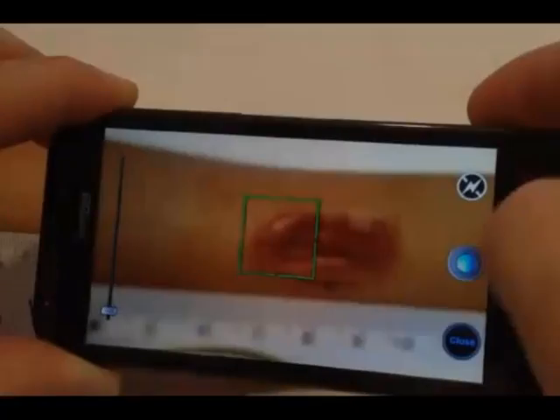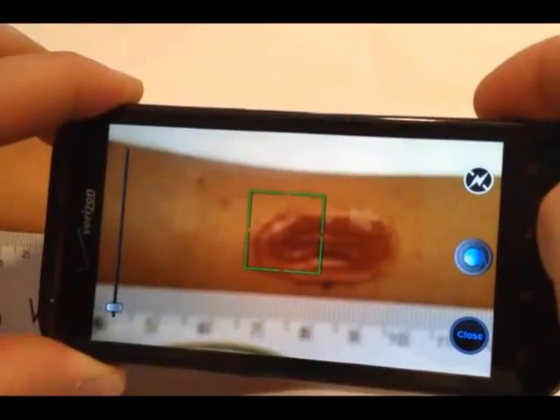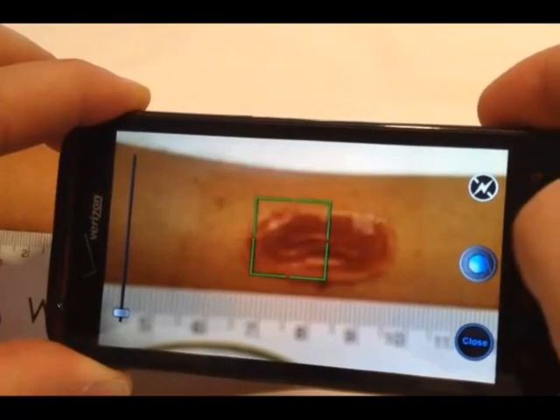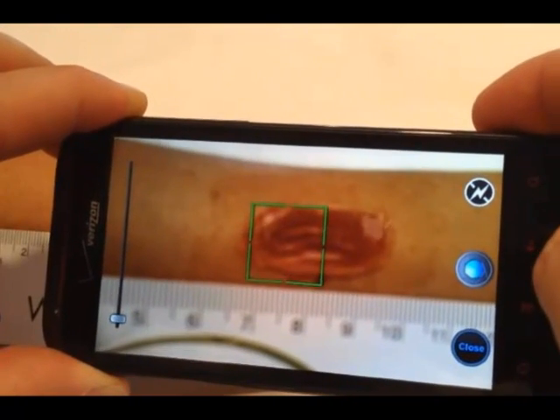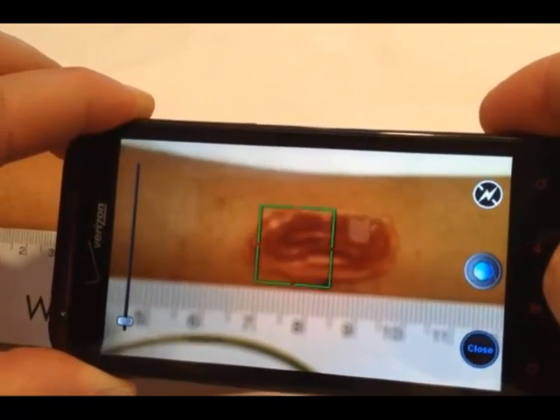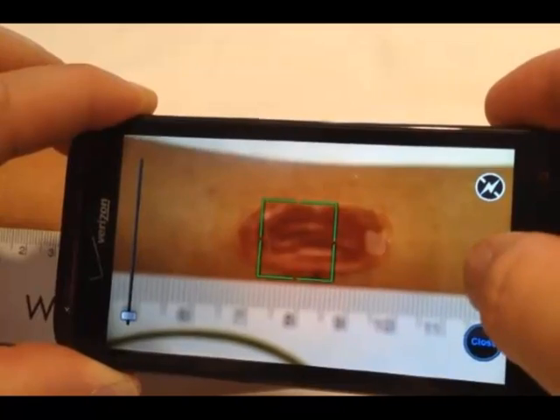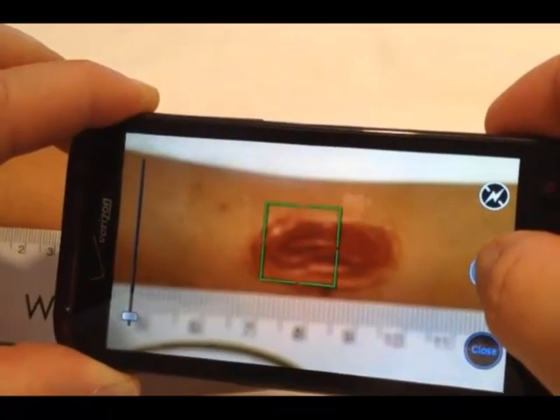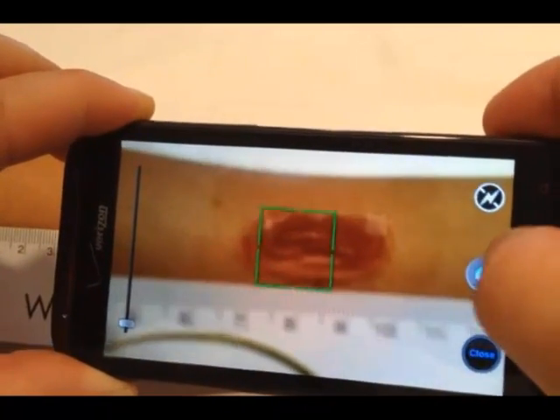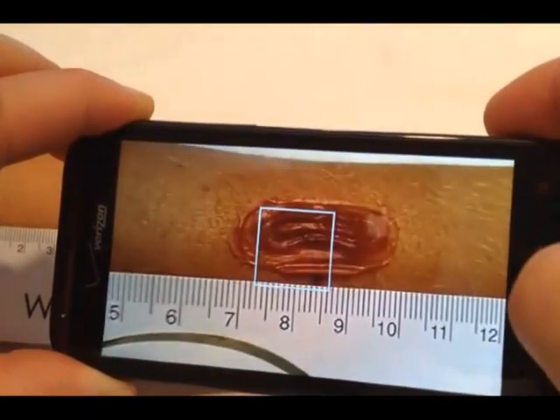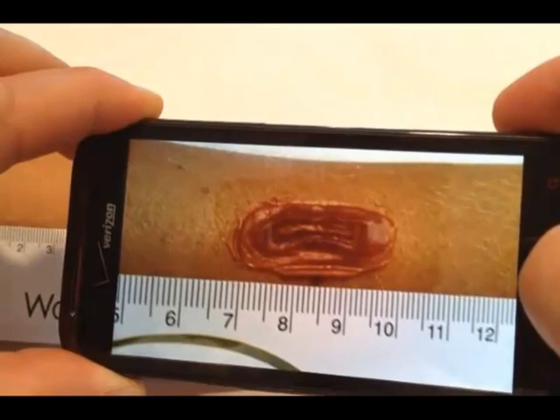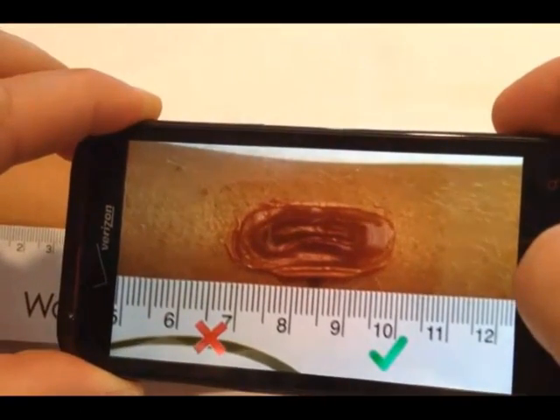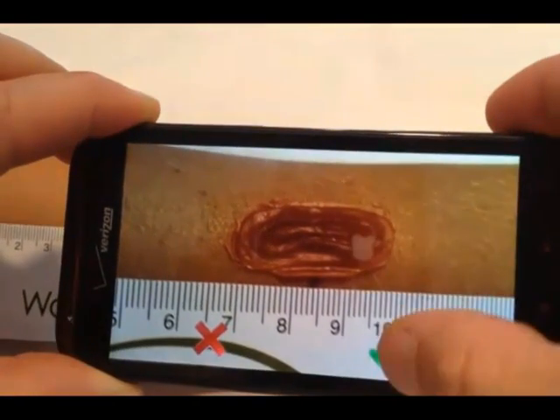Next, hold the camera in the landscape or horizontal position. Hold the camera steady and then tap the camera button. If you are happy with your picture, tap the green check mark. If you want to retake your picture, tap the red X.